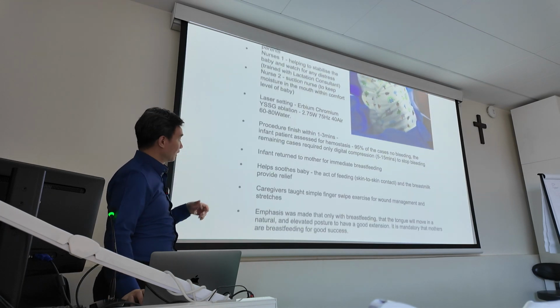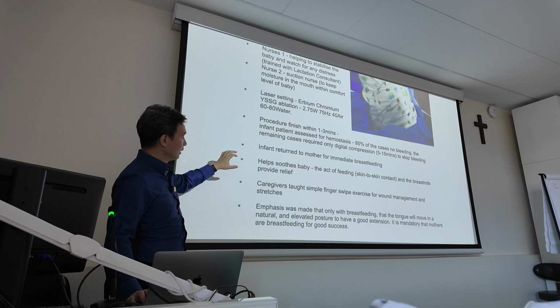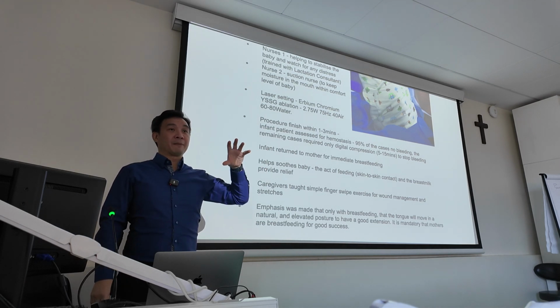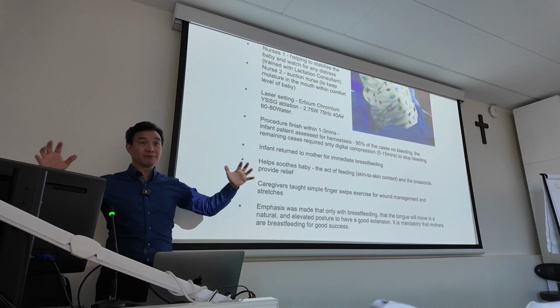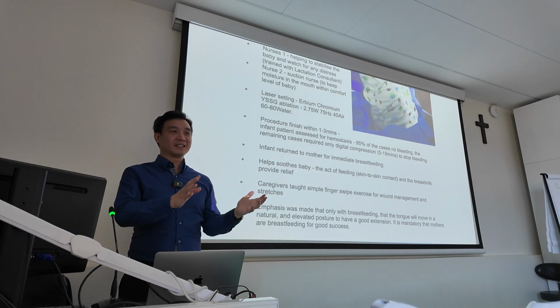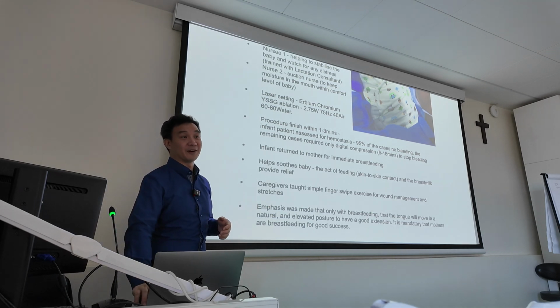Okay. So of course, using the laser, the setting, and then finish in 1 to 3 minutes, return the baby to mommy, soothe the baby, usually with breastfeeding. Interestingly, they talk about how to stop the bleeding in a few cases. One group from Indonesia, they are pediatricians, and they have been dealing with many babies for the past 8 to 10 years. She said, don't worry about bleeding, just put the baby to the breast, breastfeeding, milk, done. Bleeding will stop. So I think we have different perspectives on how to do it.